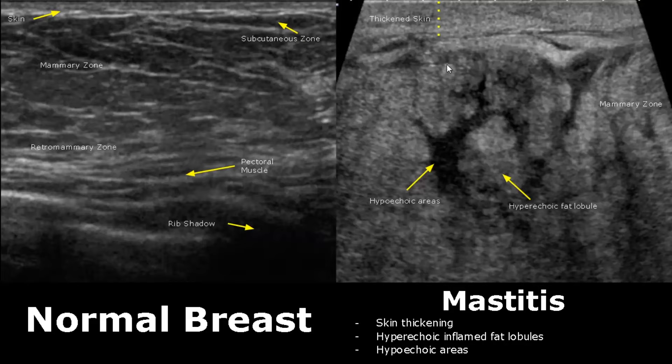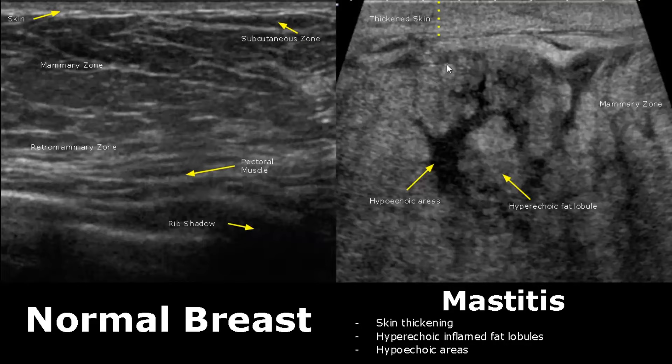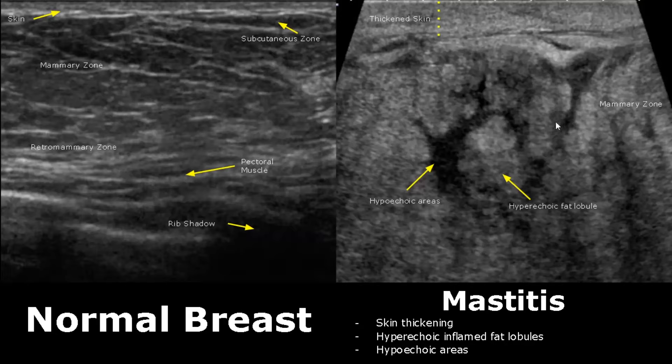Mastitis is the inflammation of breast tissue. Its appearances consist of hyperechoic fat lobules and some hypoechoic areas. Another distinguishing feature is thickened skin — you can see the skin is very thick compared to the normal image. These are the features of mastitis.